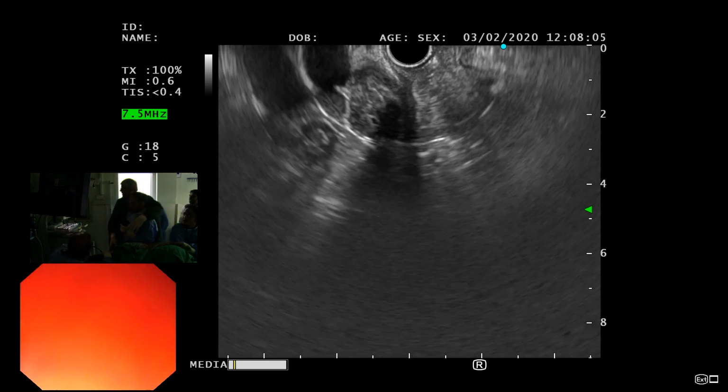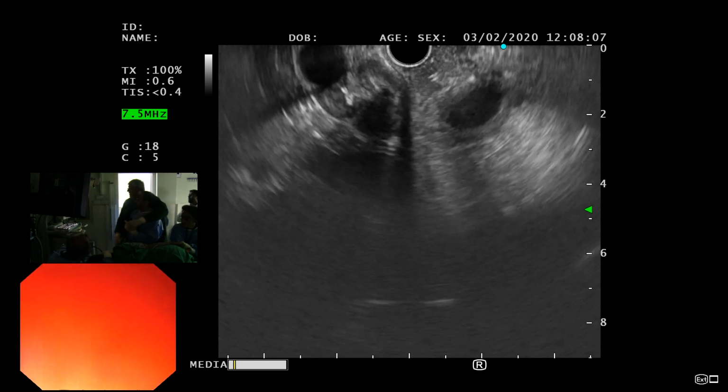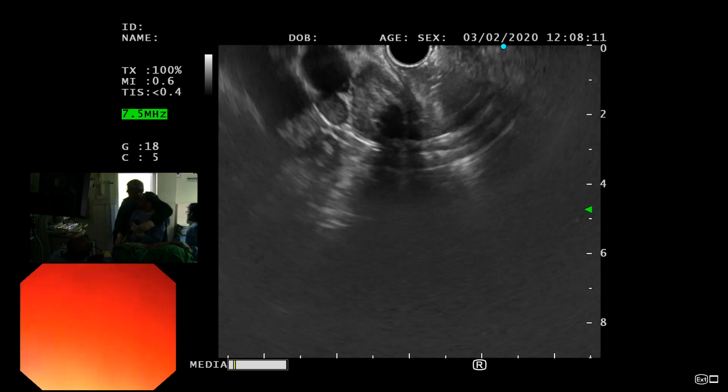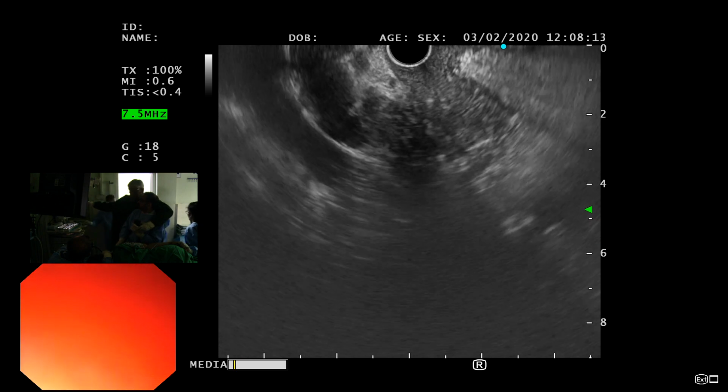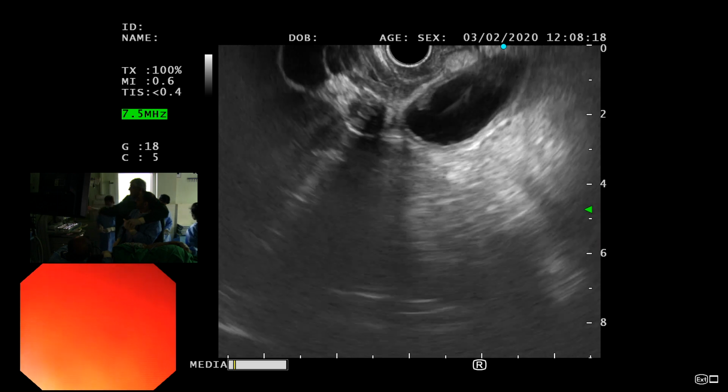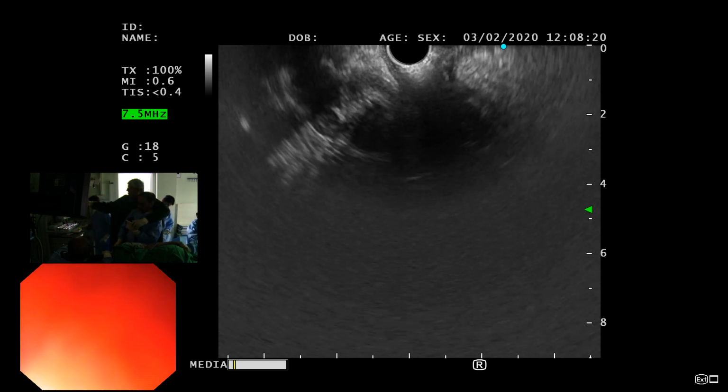So now अब आप straight रखेंगे, and when you go clockwise, your stent is going up. When you go anti-clockwise, you're going towards the duodenum. That's all you're doing. ठीक है, tip up कर लें थोड़ी सी, just a little bit. So you can follow this stent now.